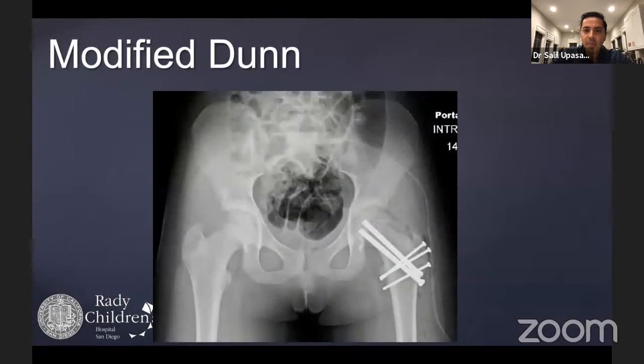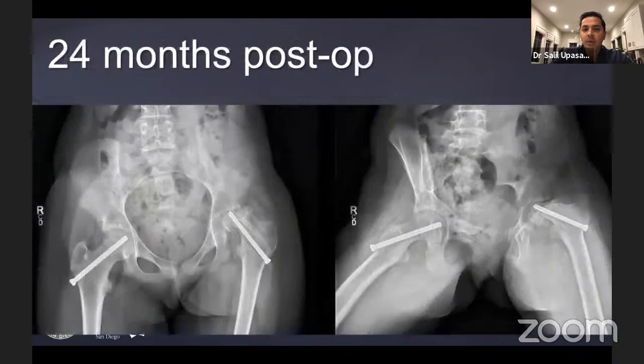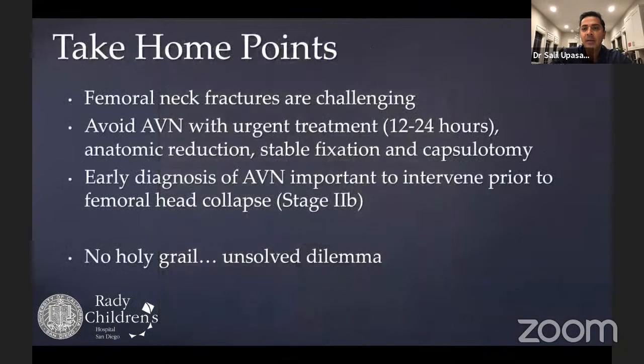So this is a 13-year-old female that had a modified Dunn procedure after a slipped capital femoral epiphysis. Similar issues with the core decompression that I discussed previously. Here she is at 2 years out from that and needed a total hip to salvage that hip.